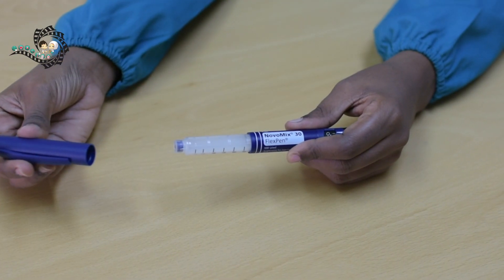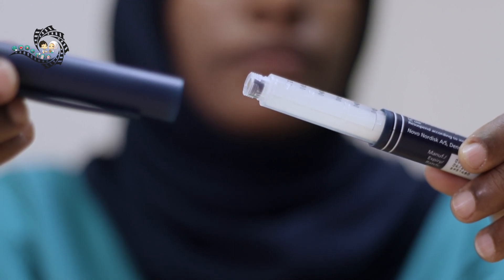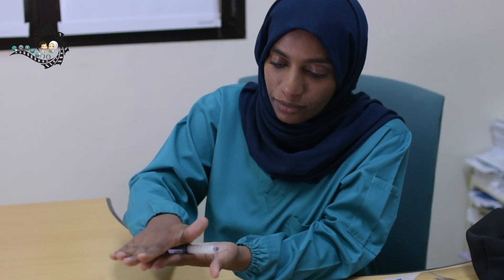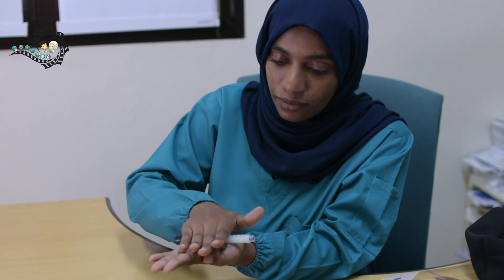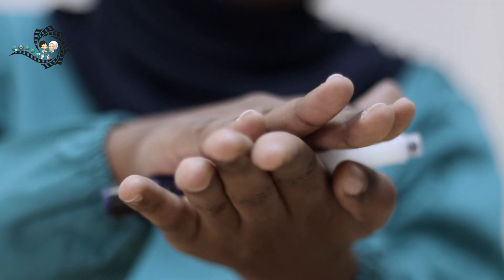Take off the pen cap. Look at the pen window and check for its color. Some types of insulin are cloudy or white in color. You should mix cloudy insulin before use. To do this, put the insulin in a horizontal position and gently rotate between your palms 10 times. Then turn the pen 10 times up and down. Do not shake vigorously because this will damage the insulin.